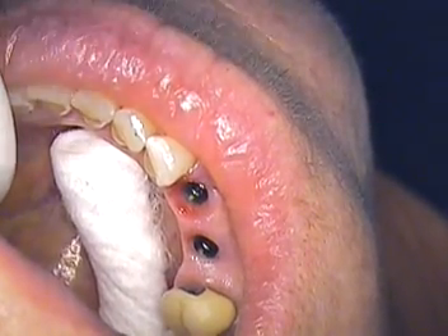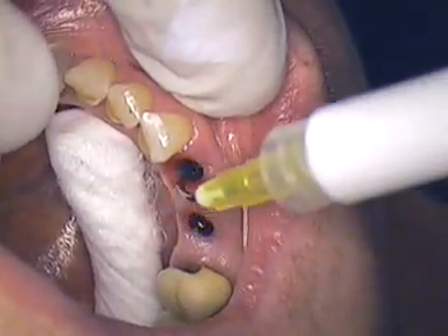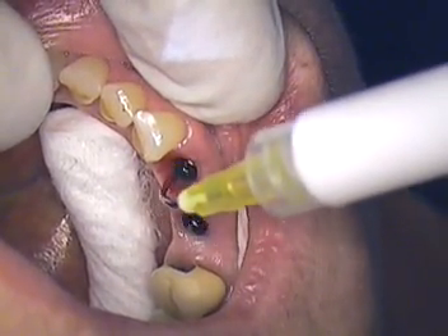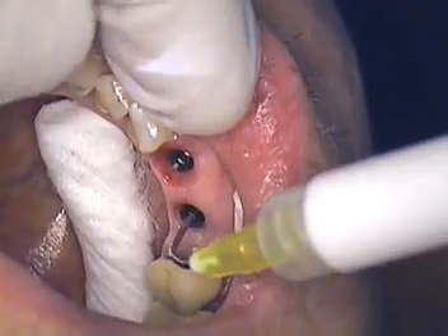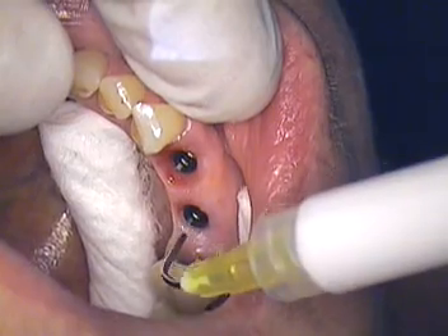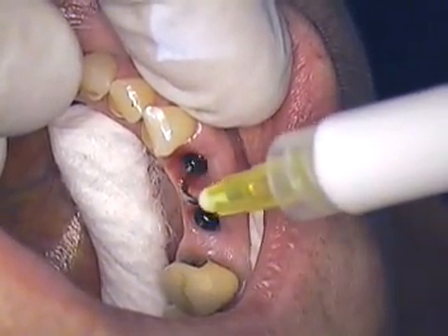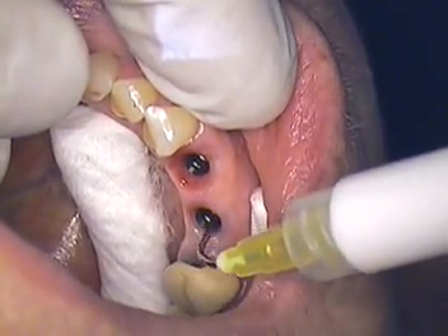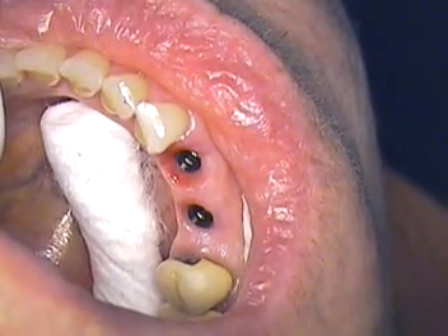Well, hello everyone. This is Dr. Jerry Cuomo here in Boca Raton. I'm completing a case that I started and putting it on YouTube. It is a two-unit case, screw retained, Strauman bone level — and we know it's more of a platform shifting type technology. These are two individual crowns and they're going to be screw retained.